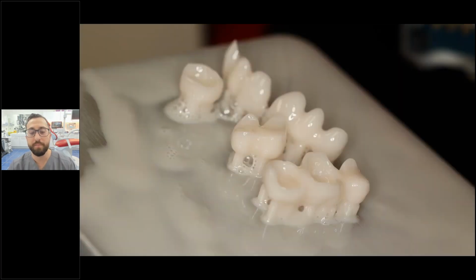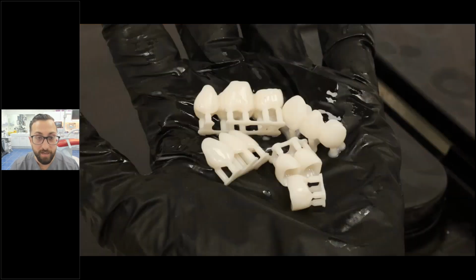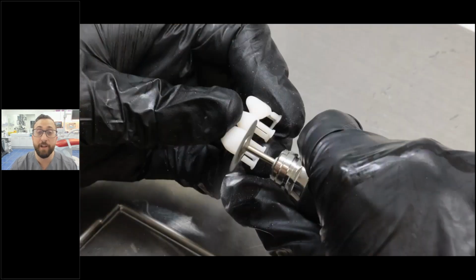But a lot of the times, with all the hype, people don't realize how much work goes into printing and processing restorations. There's just a lot of social media showing off and talking about how good printed restorations are. But a lot of people need to appreciate this is what they look like when they're printed. Oftentimes you have quite large sprues and it's just dripping with resin, and you have to take these restorations and wash them multiple times, at least twice, and brush them and clean out all the excess resin. And then you have to cut every single sprue.